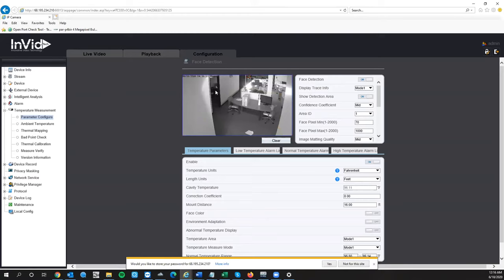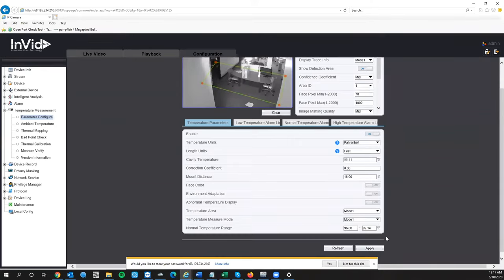After detaching, scroll to the bottom and hit Apply to finalize and save your detection box. Keep in mind you won't get a detection reading for anyone walking behind the calibrator. Once your box is set, the very next step is to make sure Enable is turned on — by default it should be on. If you turn off face detection, you won't get a temperature reading, so don't turn that off. Show Detection Area is useful during setup — you can turn it off later if you don't want the green box visible in the live view.